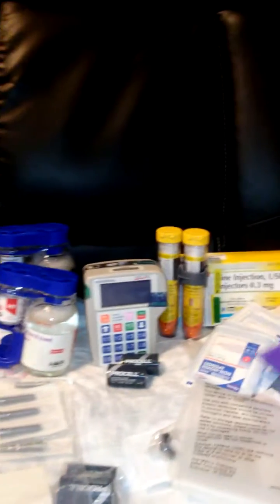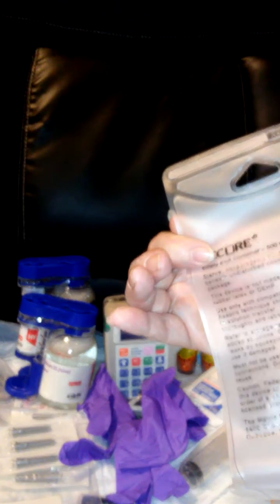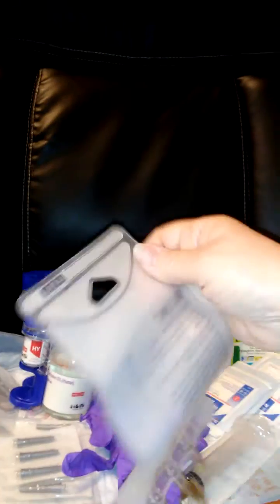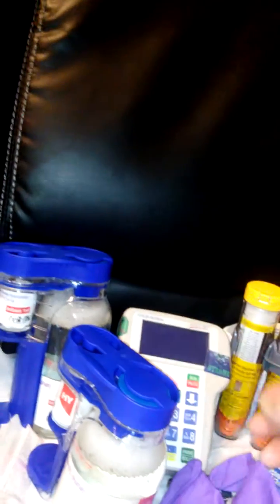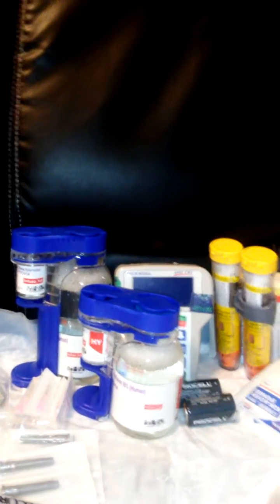When I start working with the infusion, I will use my gloves. But right here is the IV bag that the HyQvia fluid will be going into, and it will hang right here as it infuses overnight. I do infuse at a very slow rate because of the amount of medicine that is going into my thighs. It does make a little swelling, like a pancake kind of swelling area. So I'm going to get right to this.